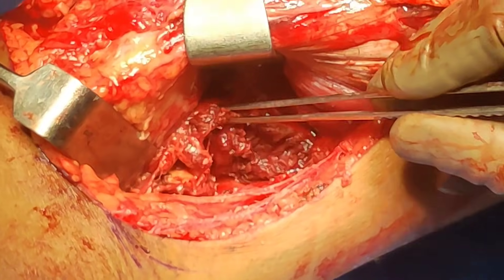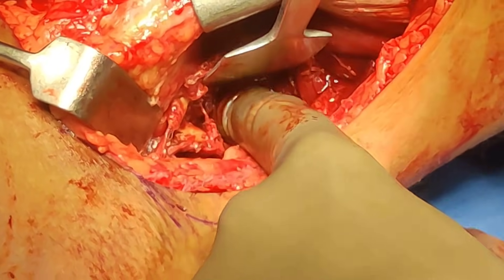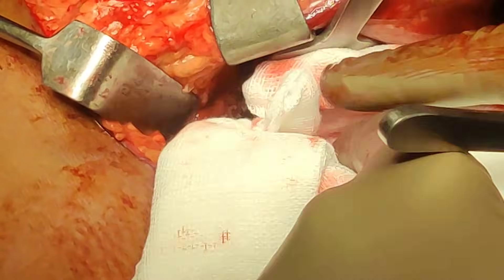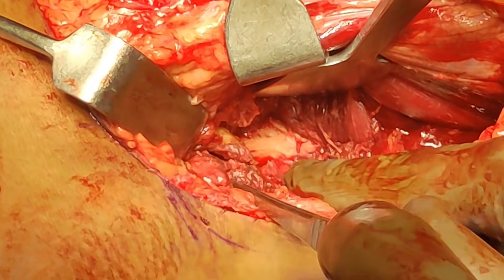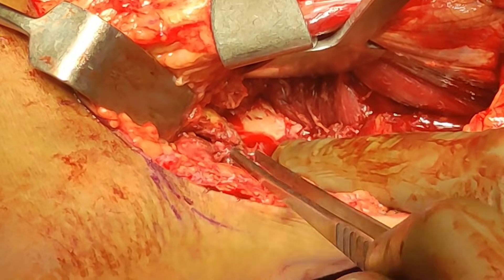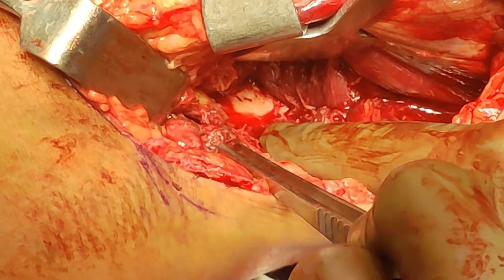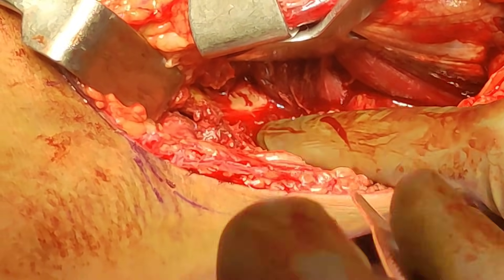Now if I put my Hohmann retractor — this is the posterior lateral side of the tibia. If I just extend this you should be able to see the fracture — there is a small fragment here. Now you have got full access to the posteromedial side and this is the central part, as I showed on the CT scan. So far we have got access to the posteromedial as well as the central part. With this prone approach you can easily plate anything on the posteromedial side. Let's first fix this and then we will see how the lateral side looks.